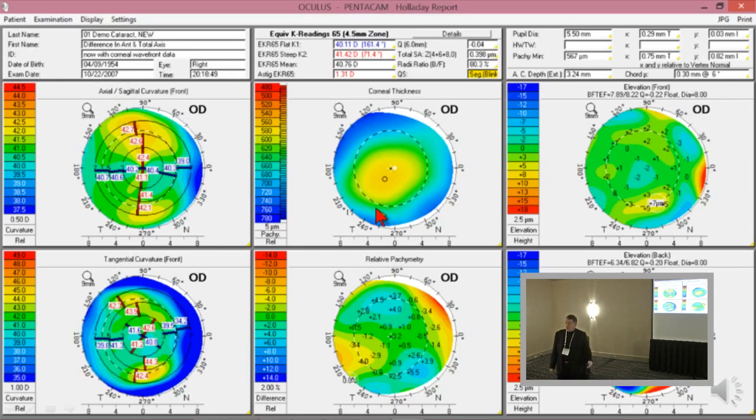By putting a drop in, it covers all the problems. In other words, you've created an artificial situation and lost the ability to detect the patient that had a problem. What they should do when they do an exam is have the patient blink several times, and then say, okay, go ahead and blink, blink, blink, blink, blink, blink. Okay, now fixate or stare. And then within half a second, they should hit that button.